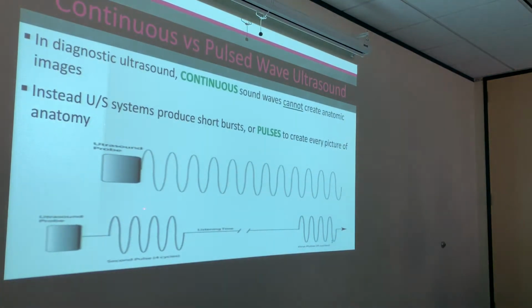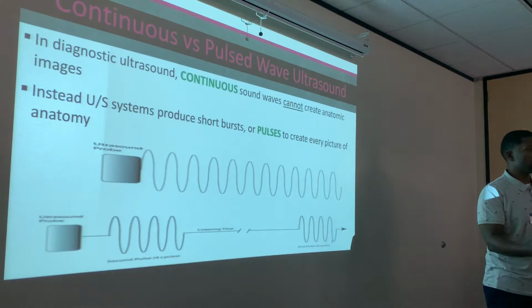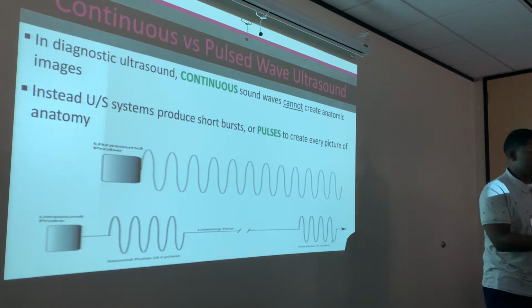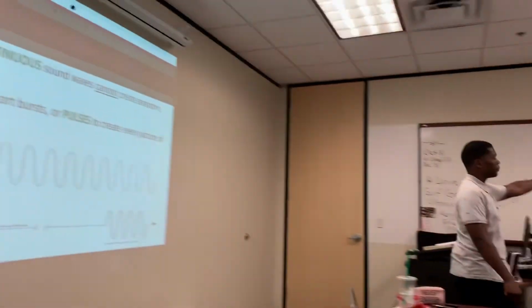So it's kind of counting out real quick. When we're talking about pulse ultrasound in diagnostic ultrasound, we're talking about 2 to 4 cycles. More than one cycle is considered a pulse. We've already learned the description of what a cycle is, right? Now we're talking about pulses, which is just putting more of these together. How many cycles do I have on my pulse sound?